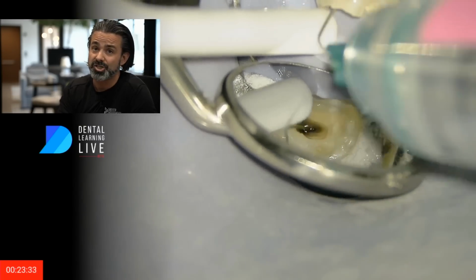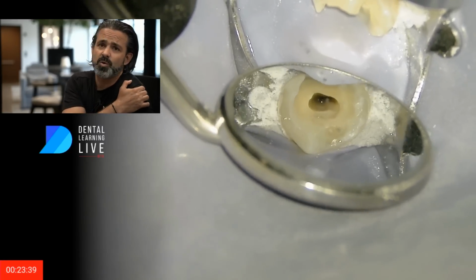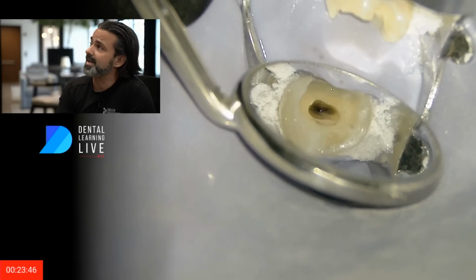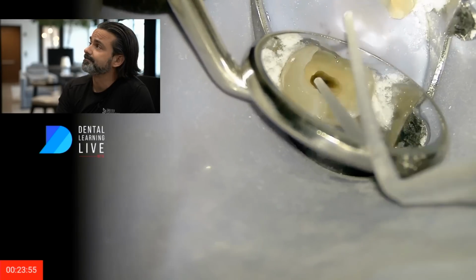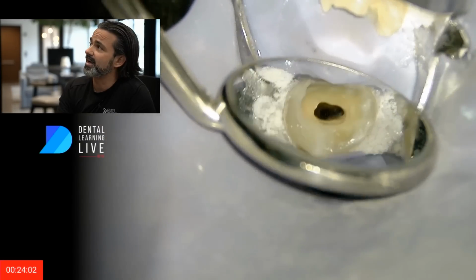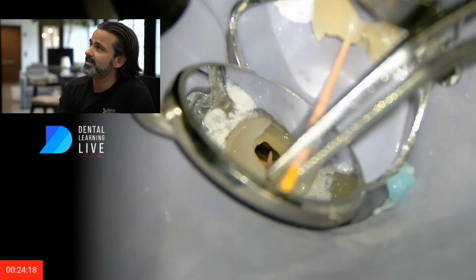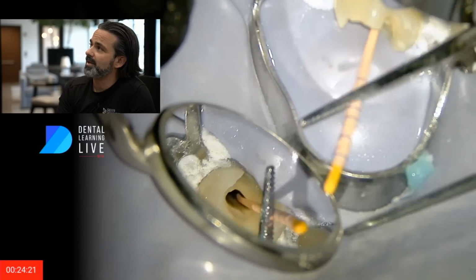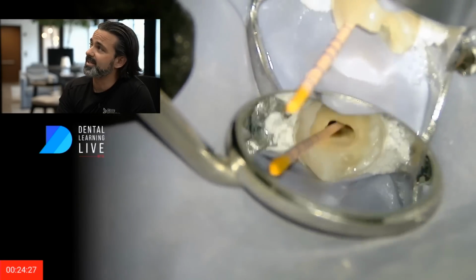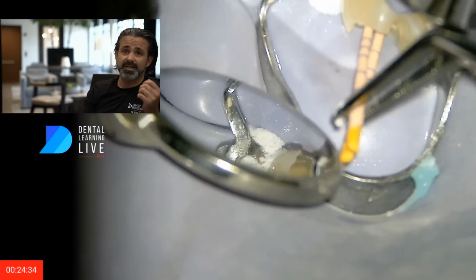Again, like I said, I was well shy. And so the thought came to me: what if I just put some cones in here and take a working length to actually document where it's at, with me instrumenting really short and where I'm at now? So I'm just going to try to dry this up so I can see the entrances to the two canals. And then my assistant Lindsay's passing me some cones. I always try to put it in the more difficult one first, which in this case is the lingual. So I'm placing that cone in there and just letting it go till it binds, and that's it. I'm just seeing where it's at, and we're going to take an x-ray.